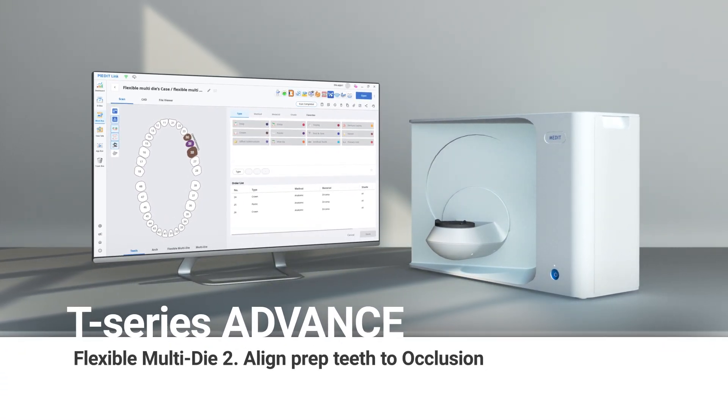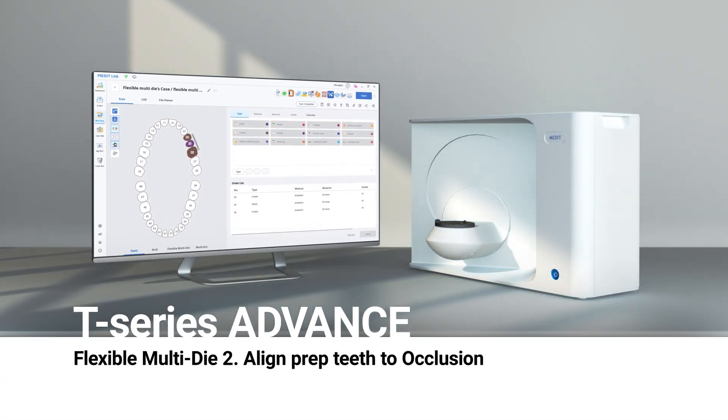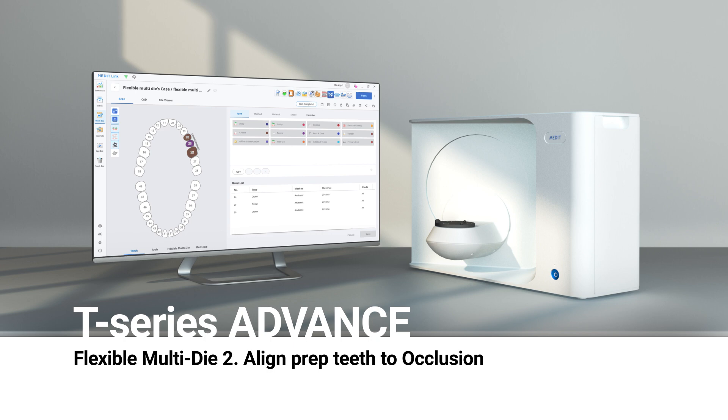This is a quick guide on how to scan with flexible multi-die and align prep teeth to occlusion. This mode is suitable for the quad size model to quickly scan and assign data.